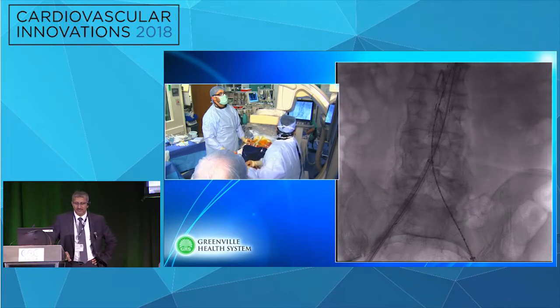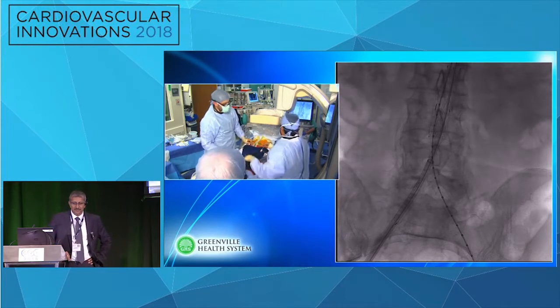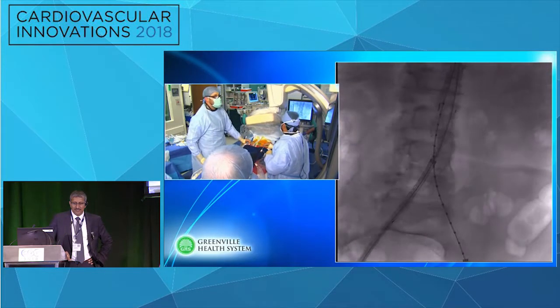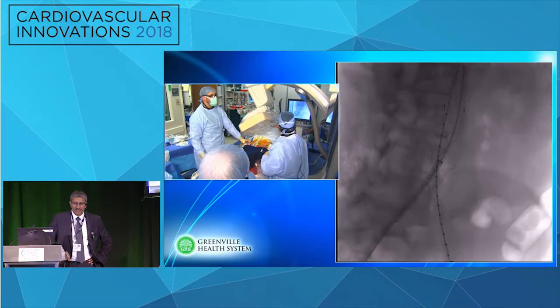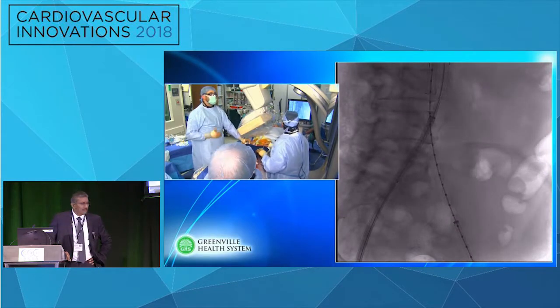Set that up. All right. Okay, so we will put that there. Let's go ahead and come down and go into an RAO. There we go, and then take cranial out. Excellent. All right. Then come on down a little bit. There we go. I like that. Good. Very good. Okay, angulation.